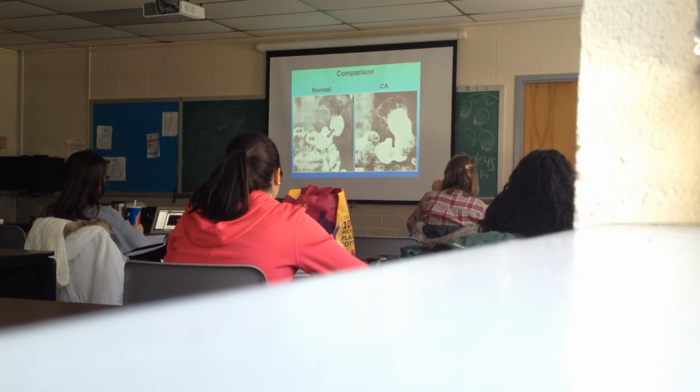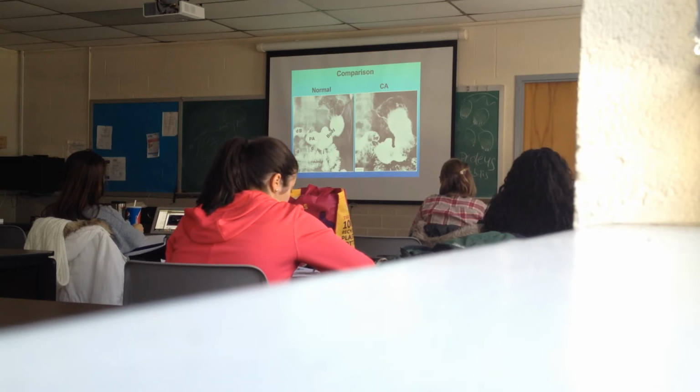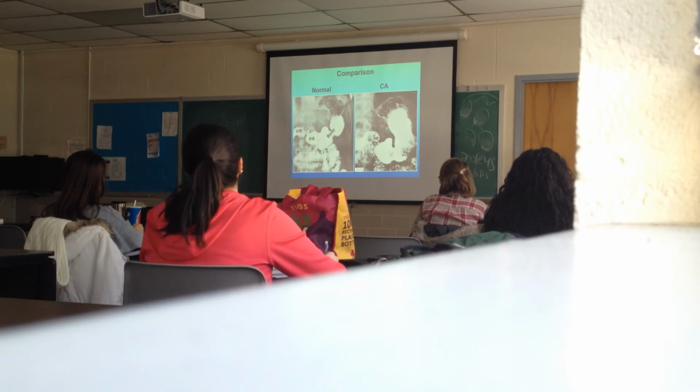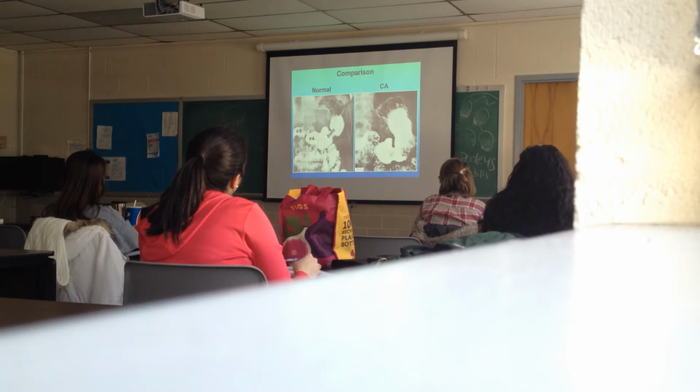You can see the corpus and antrum are filling uniformly with barium. There happens to be no food in the stomach. This GI tract was prepared, evacuated of all food, and so it all fills up nicely with barium. If there were food in here, you'd actually see filling defects. But there's no food in here, so everything fills up nice and completely with barium. Everything's nice and uniform. No filling defects at all.